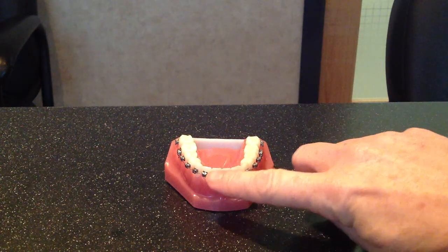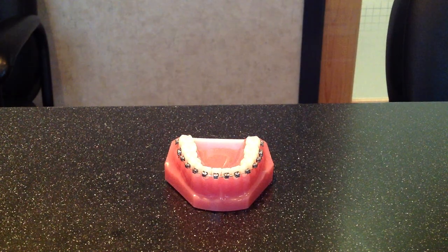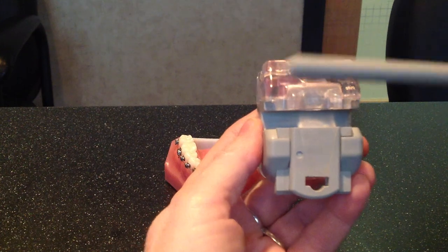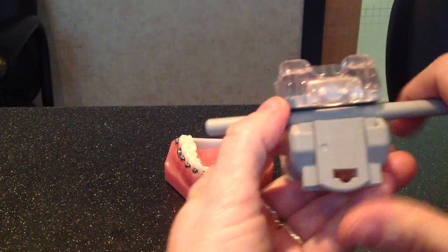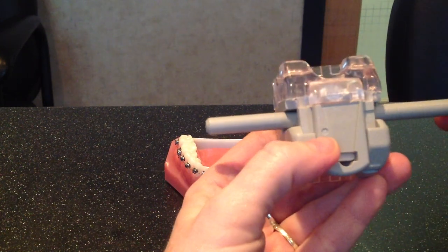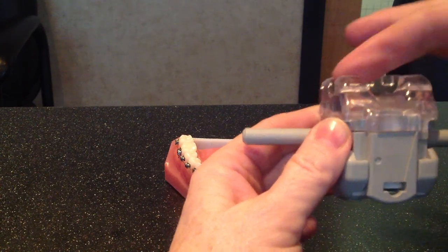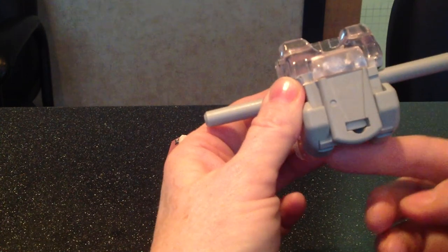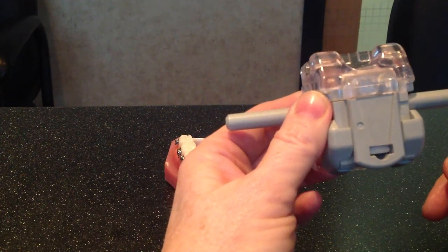Braces are just glued right onto the front of your teeth. I'm going to use a large model to show you how our braces are made. This is the brace we use here in our office. It has a little wire that goes in there and a little door that closes to hold the wire in place. There are four little hooks — one, two, three, and four — and that's where food and plaque gets stuck, and that's where you're going to concentrate on brushing your braces every day.